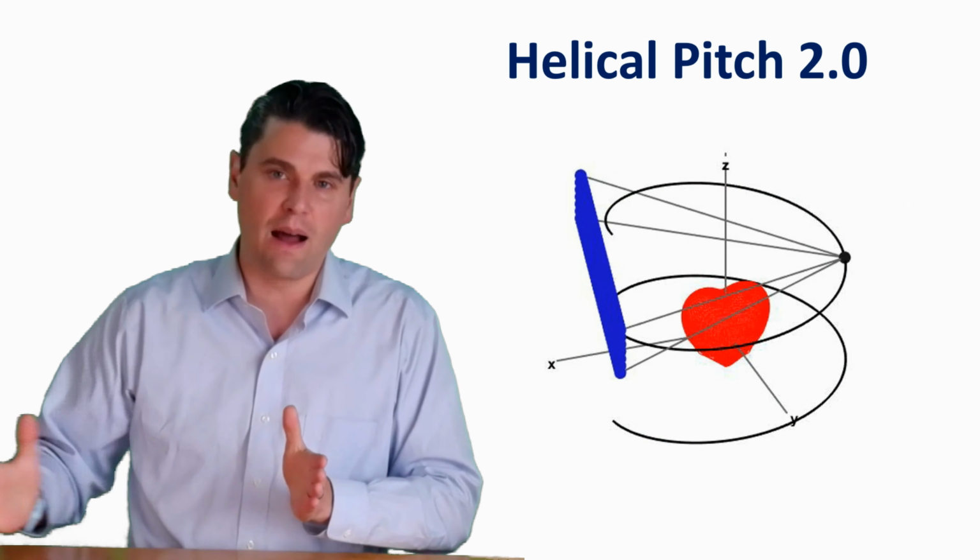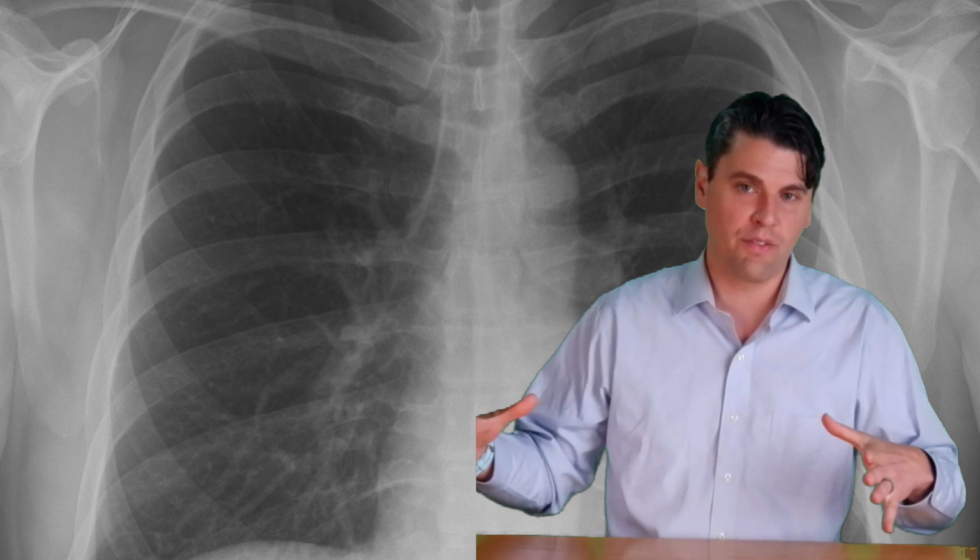It is possible on some modern systems where you have 2 X-ray tubes and 2 detectors to actually use pitches higher than this, because in that case, you can use the extra tube to get that extra sampling. There are modes that are used clinically that have pitches that exceed 3 when you want to have this really fast scanning, but you're okay with some level of artifacts at the outside of the DFOV.